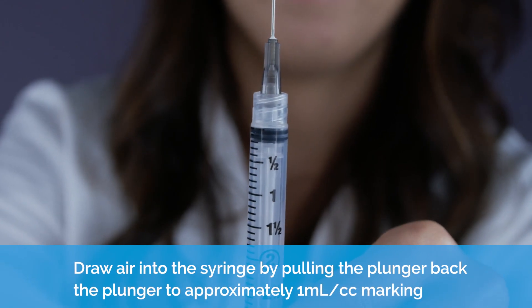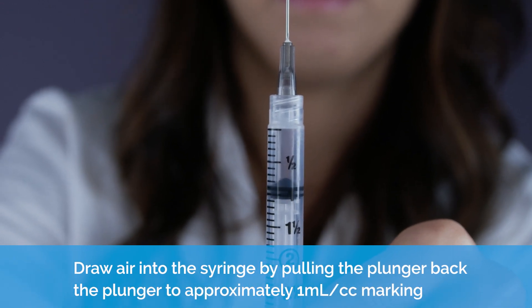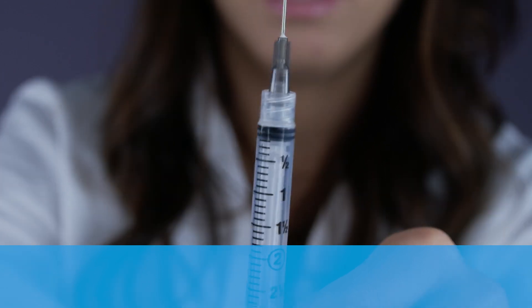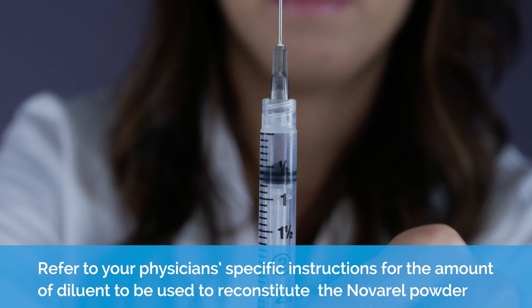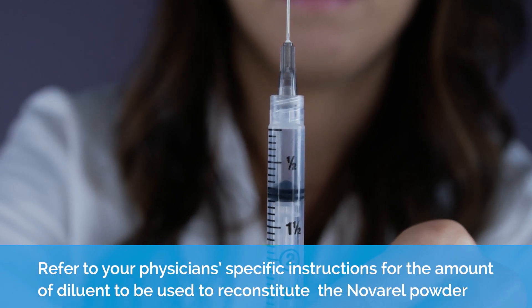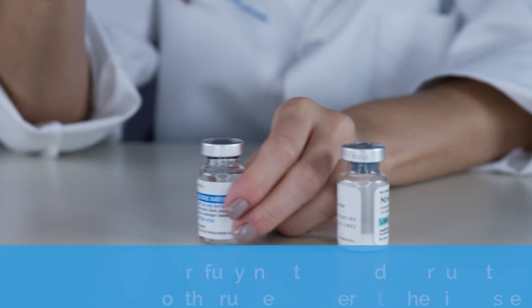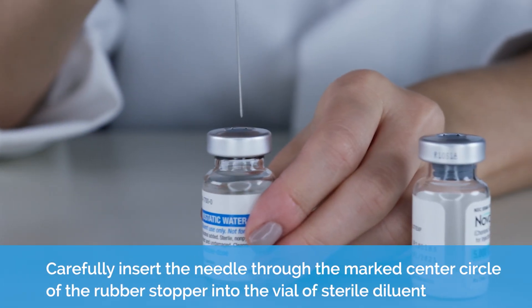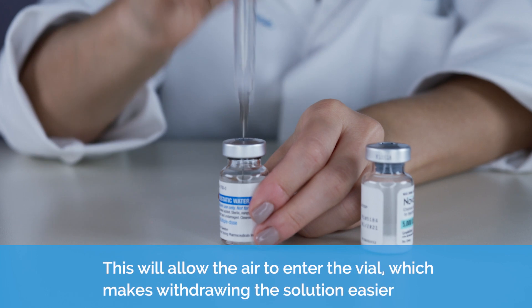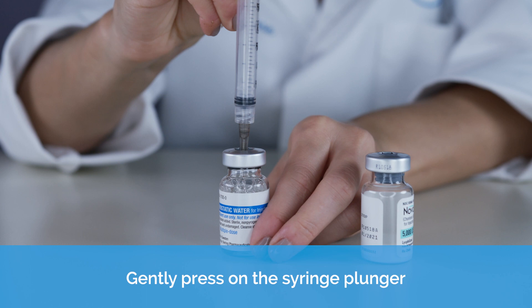Carefully pull or twist off the needle cap. Draw air into the syringe by pulling back the plunger to approximately one milliliter or one cc marking. Refer to your physician's specific instructions for the amount of liquid to be used to reconstitute the Novorel powder. Place the vial of liquid on a hard flat surface. Carefully insert the needle through the marked center circle of the rubber stopper into the vial of liquid. This will allow the air to enter the vial, which makes withdrawing the solution easier.